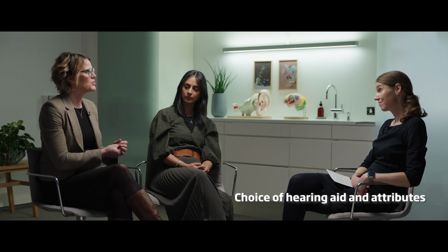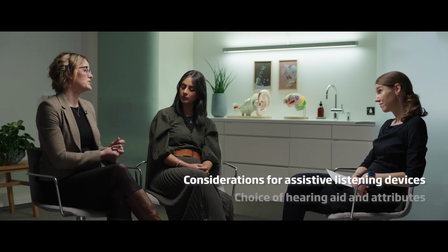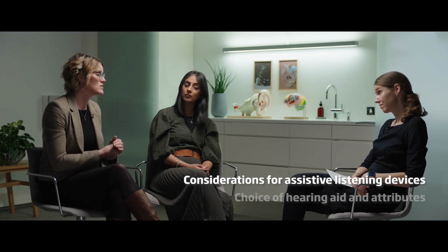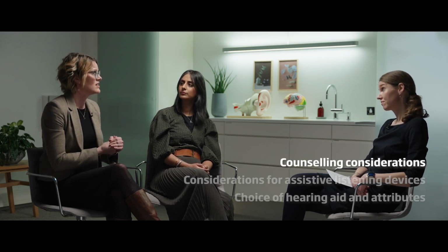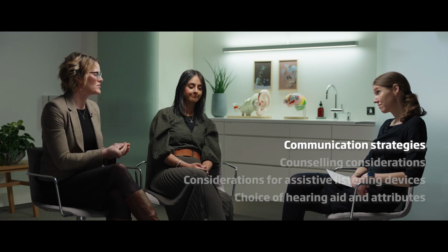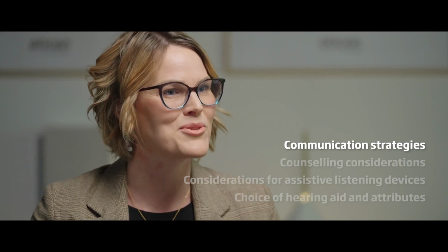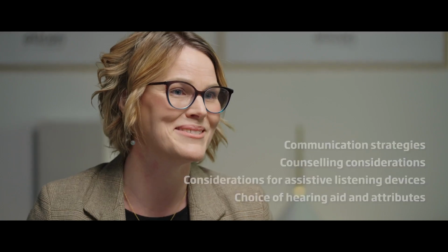But I think also importantly, if your client has a more severe ACT score, it could be you want to emphasize assistive listening devices or counsel a little bit differently on expectations, what kind of communication strategies to use once they walk out the door. Because regardless of how we help with the hearing aid, they're going to need those extra strategies as part of their new life with hearing aids. So I see a lot of interesting perspectives in this, and I can't wait to get started.